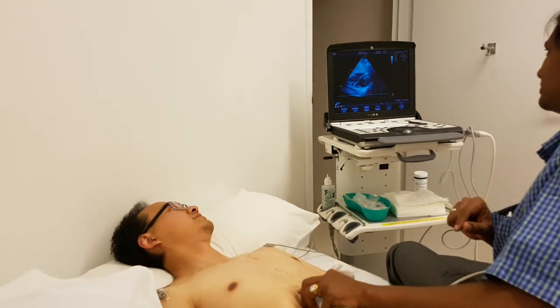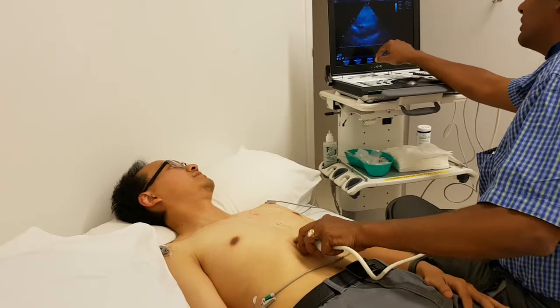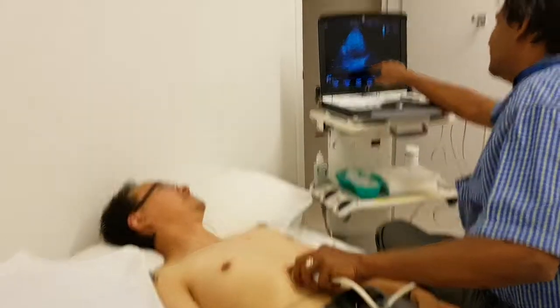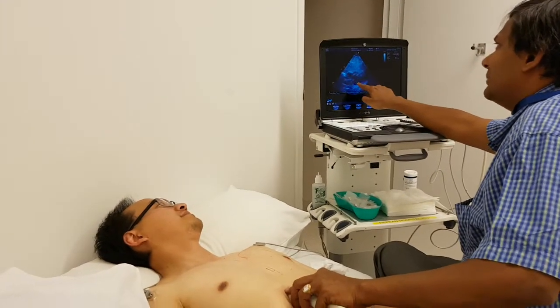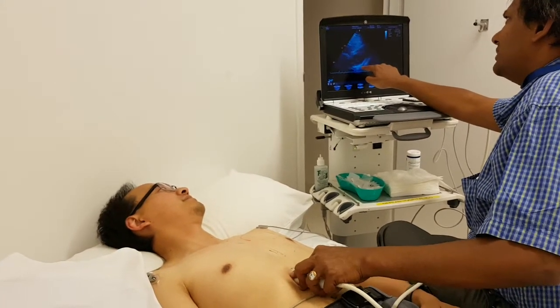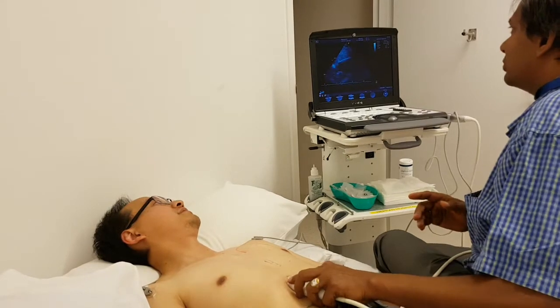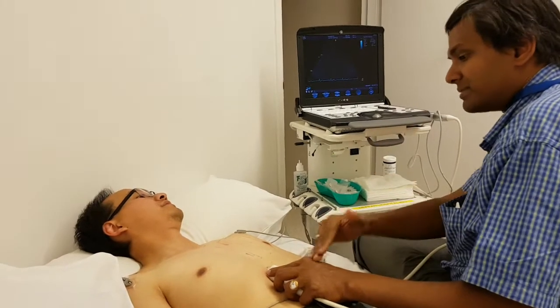I'm going to move a little bit more towards the right side to get rid of the stomach interference. Right ventricle, left ventricle, right atrium, tricuspid valve — I'm not able to really see the left atrium very well. I'm going to rotate and see whether I can open it up. I can see the mitral valve now. For a slightly more advanced technique, you can get the same short axis views from the subcostal view as you would from the parasternal.